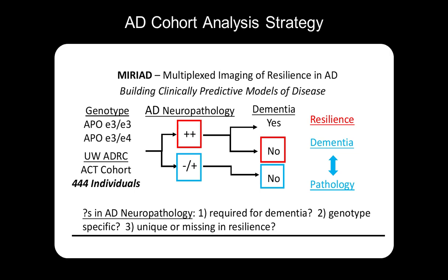If they have no neuropathology present for Alzheimer's disease in the hippocampus beyond regular aging, this person almost certainly never had dementia. However, there are often cases where you do have neuropathology typically associated with cognitive decline, and this person will have documented cognitive defects at the time of death. But there's also a subset of patients who present with significant neuropathology who, at the time of death, were not cognitively impaired versus what would be the expectations at that age.